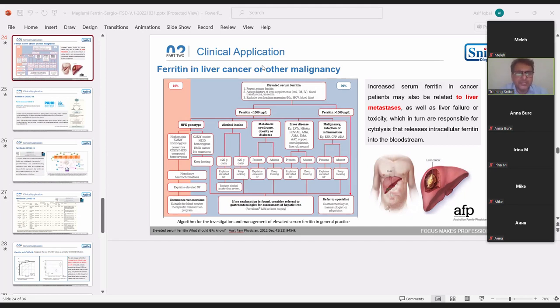But in my experience, if the workload is low, the Maglumi SNIBE assays have a capability: you can take it out from the onboard, put a tape on the top of the reagent and put it into the refrigerator. If there are no patients coming or the samples are fewer, you perform the run and then place it into the refrigerator.